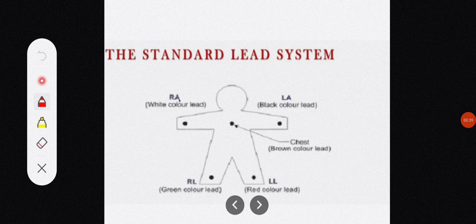So what I am trying to tell you is that for recording the electrocardiogram, we need electrodes. In this lecture I am going to discuss the electrodes and the lead system, or you can say the arrangement of electrodes, used for the measurement of the electrocardiogram.